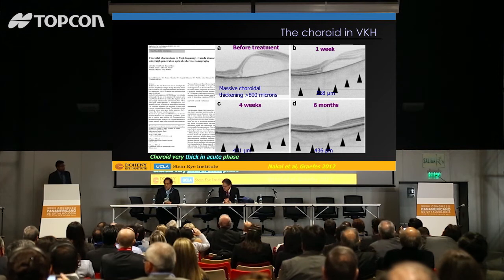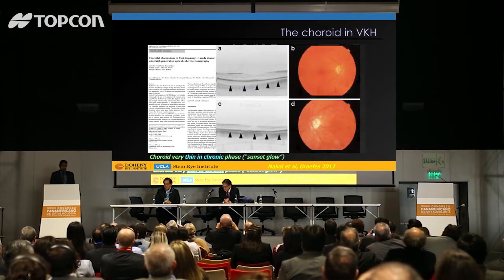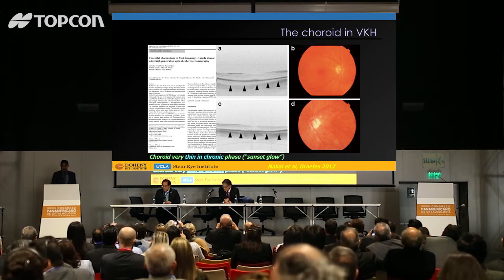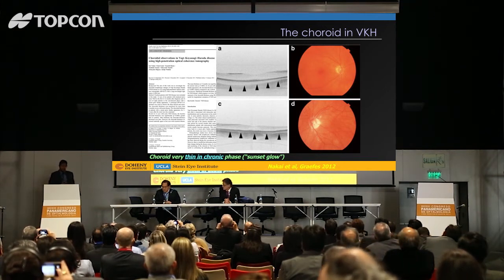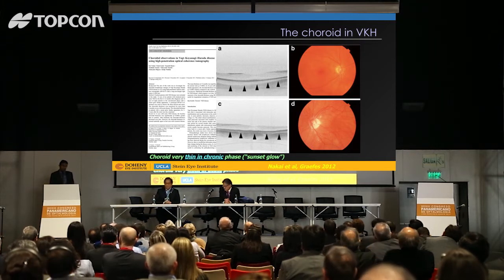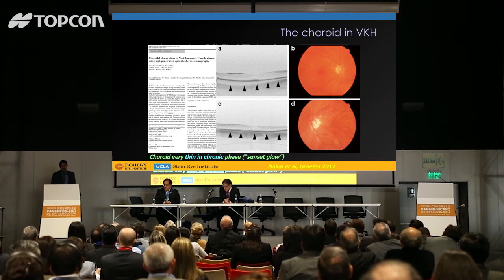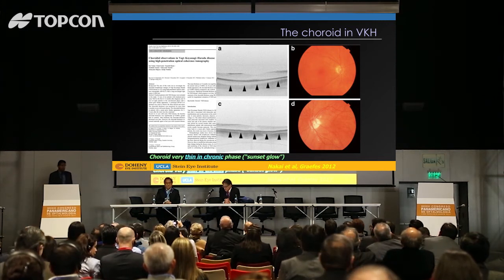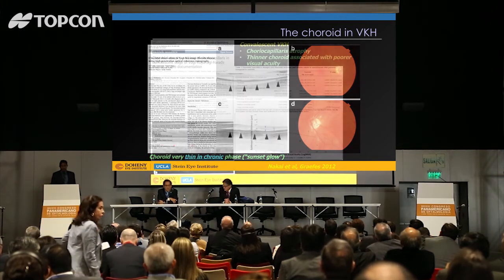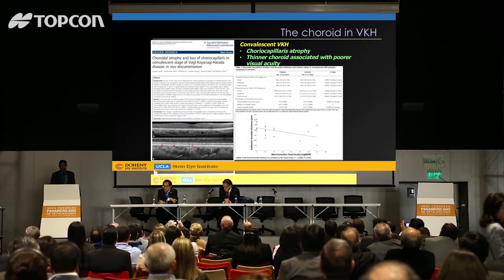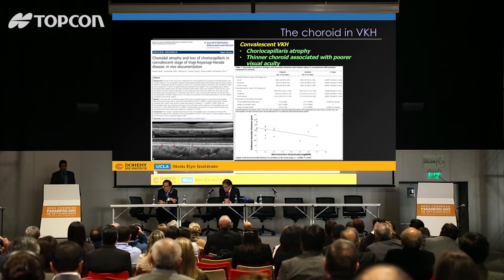We know in Harada's disease the choroid can be massively thickened to the point that even with swept source OCT we cannot visualize the posterior surface. But we also recognize that with treatment, the choroid thins. Many of us use OCT imaging of the choroid and track the progressive thinning as a nice way of monitoring therapeutic response with inflammatory agents. In patients who develop chronic disease, the choroid can get quite thin — that thinness actually contributes to the so-called sunset glow appearance of the fundus. Patients who develop an especially thin choroid seem to have poor vision, making it a nice biomarker for functional outcomes.